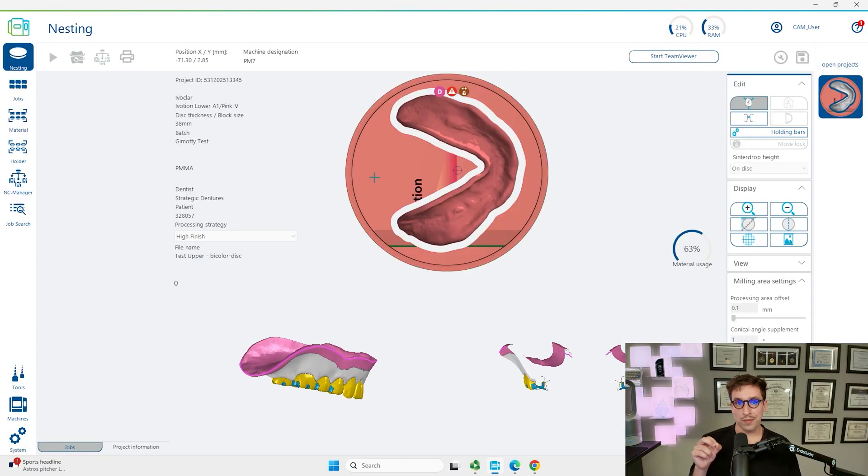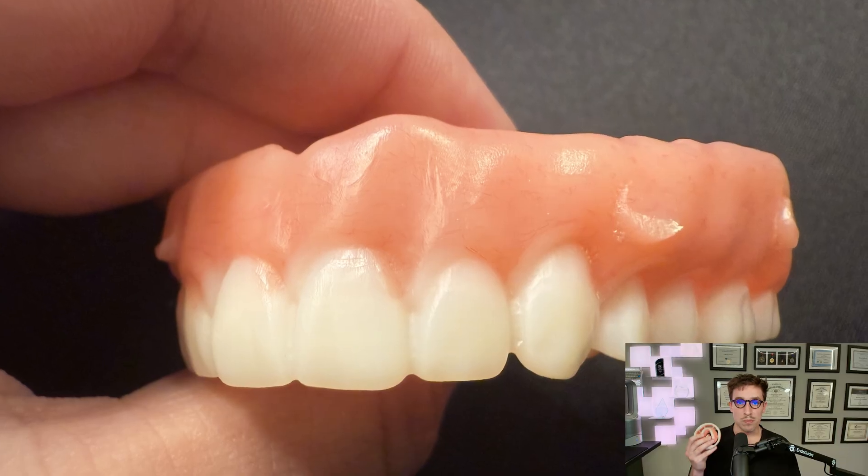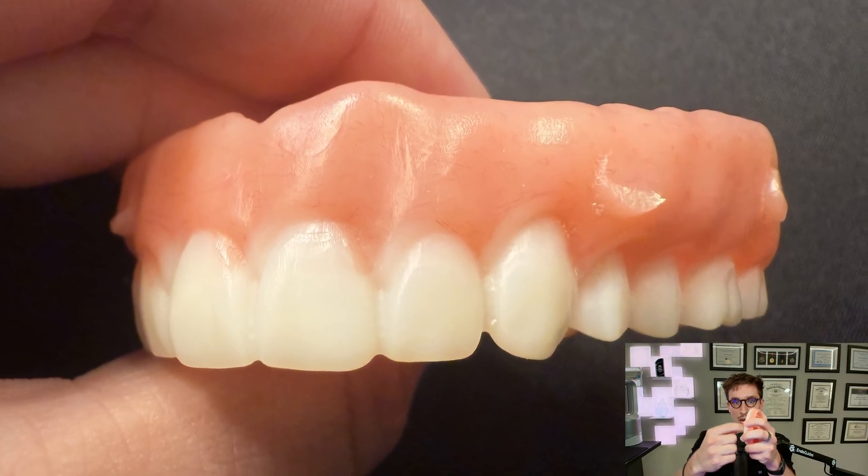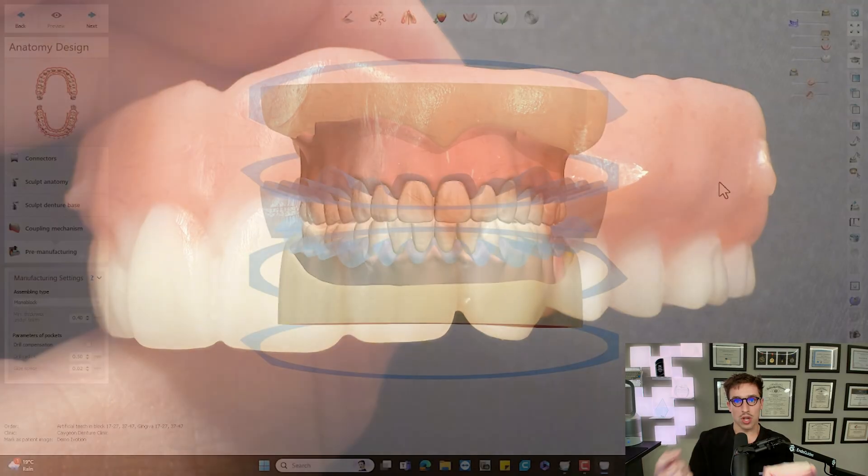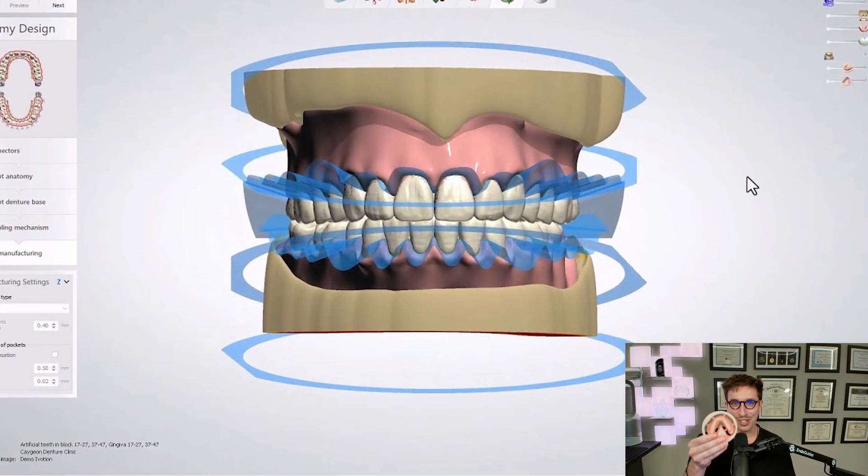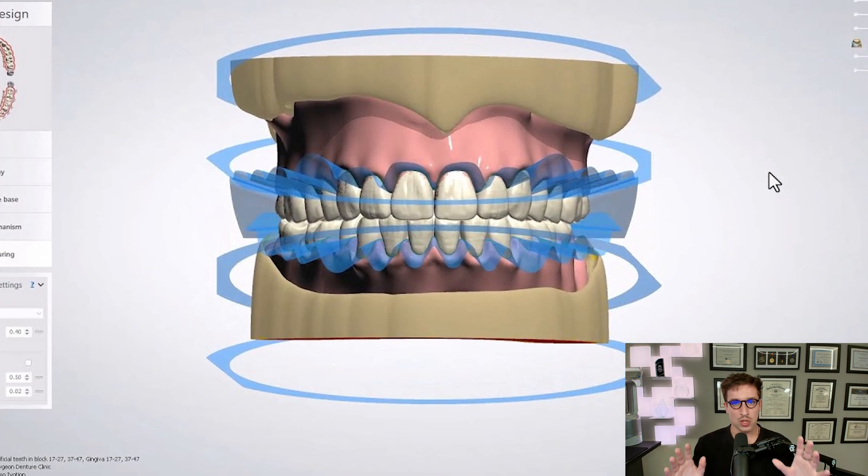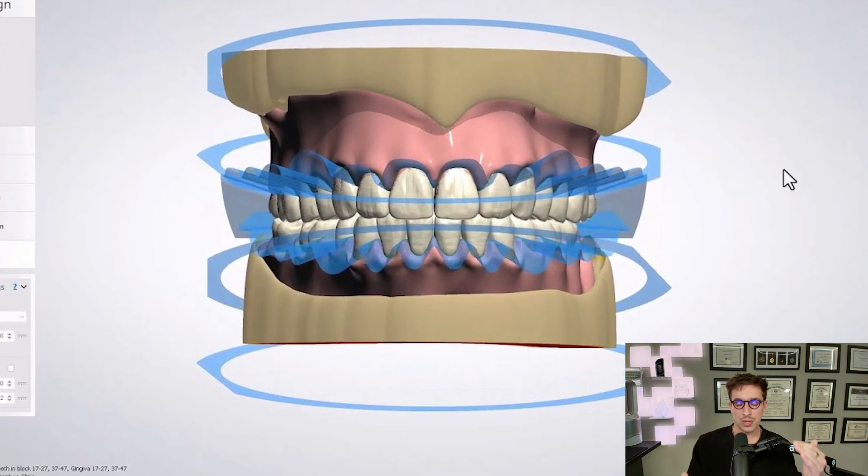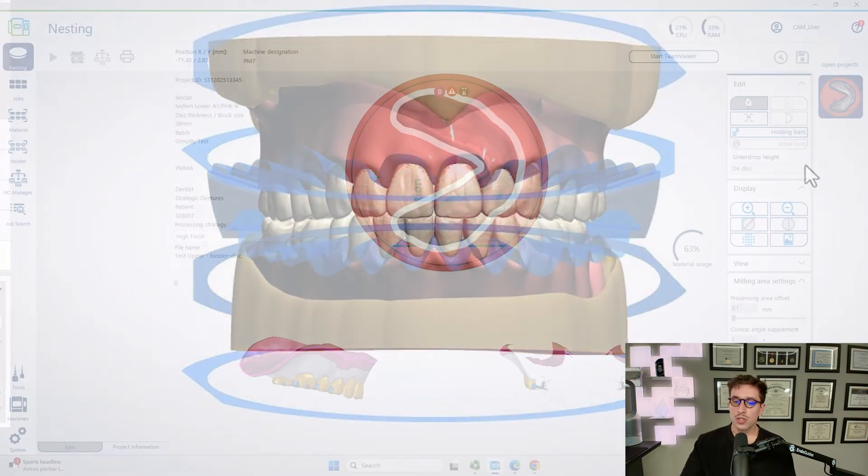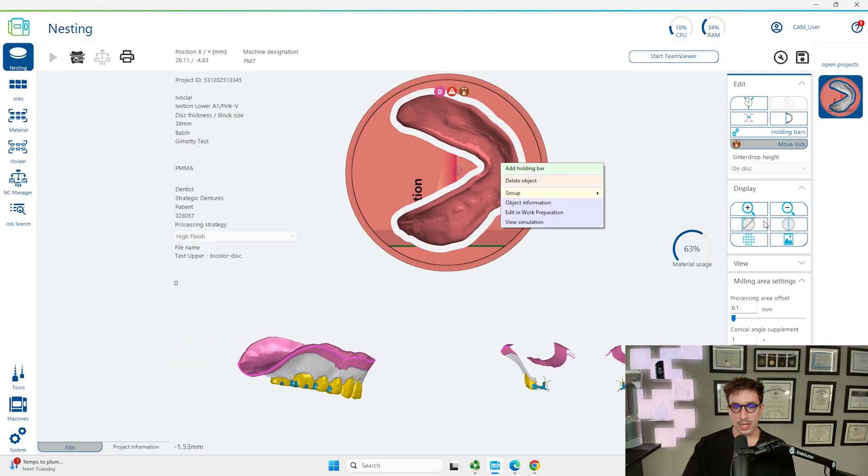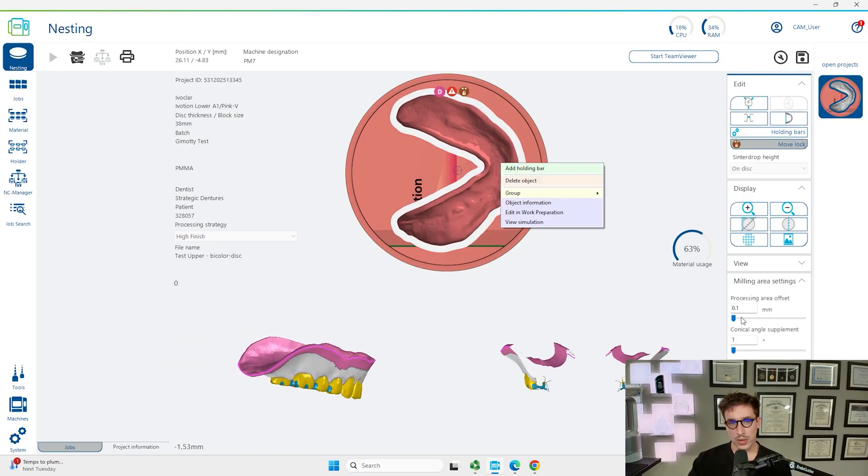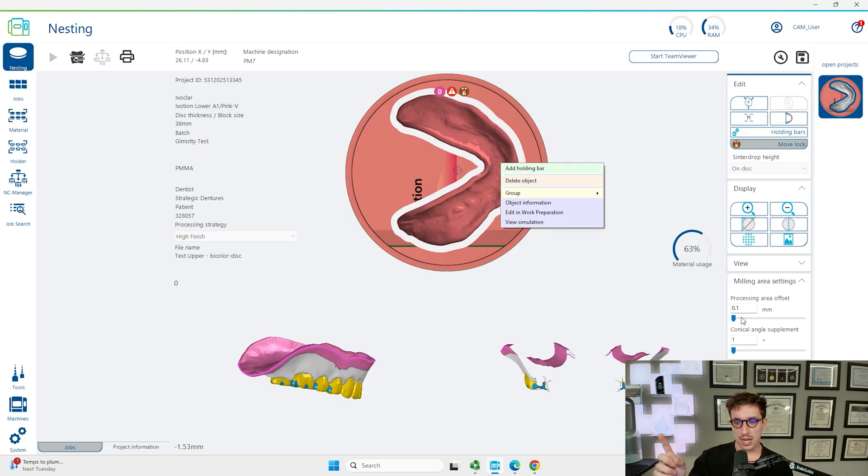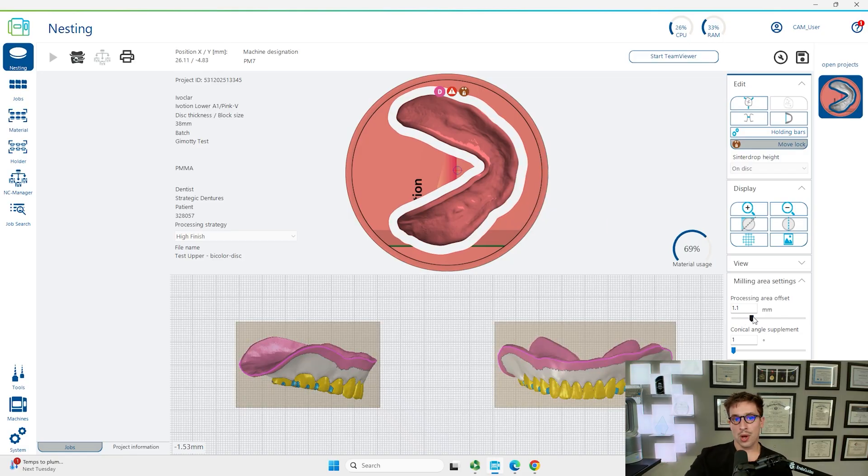What's really important for these is that because these are monolithic, the nesting needs to be done automatically. If the nesting is moved at all, then the gingival margins will not line up because that blue line from our design software is not going to line up to the blue line that's actually on the puck. That blue line is just the delineation between the gingiva and the tooth colored material for your puck.